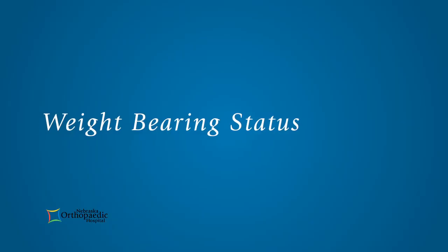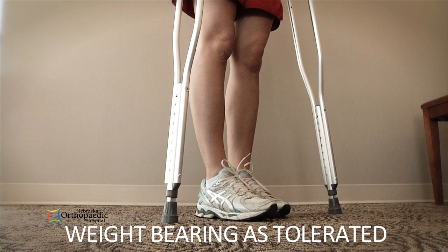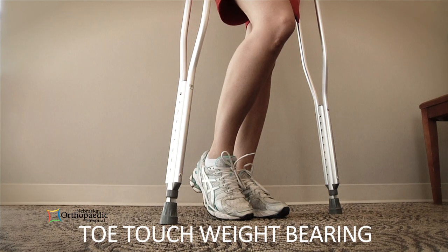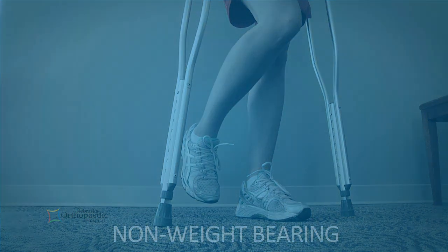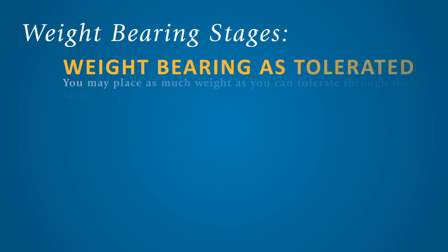Before walking, be aware of your weight-bearing status. This is the amount of weight that you can safely put on your leg after surgery and should be determined by your doctor. Do not advance your weight-bearing status until instructed to do so by your physician or physical therapist. The different weight-bearing stages consist of weight-bearing as tolerated.